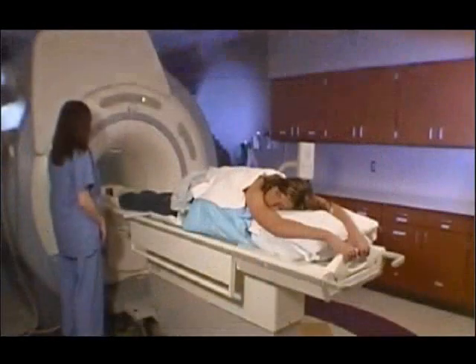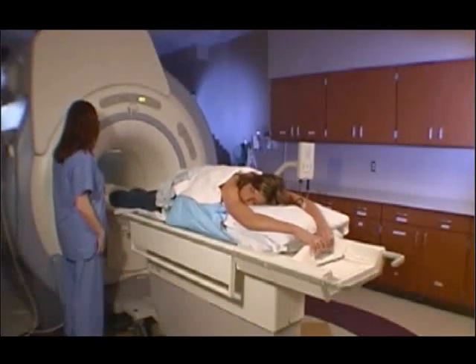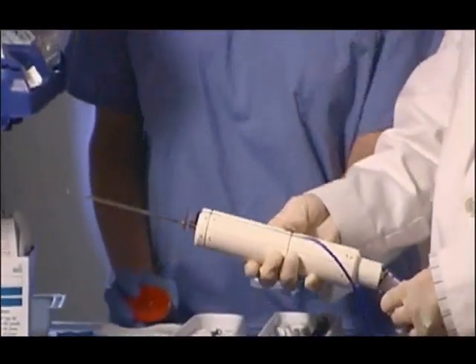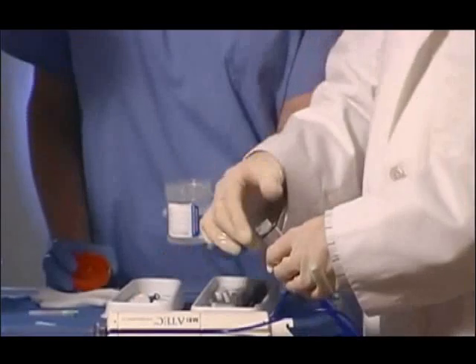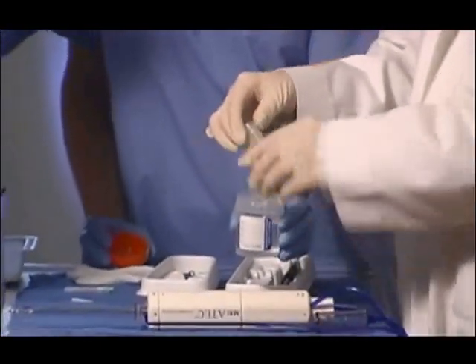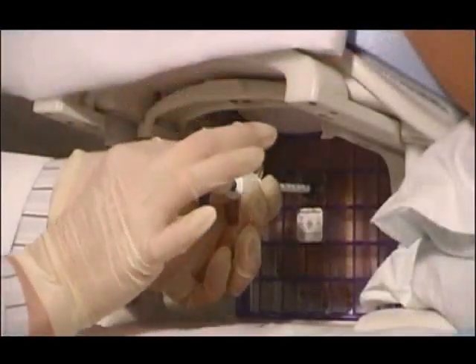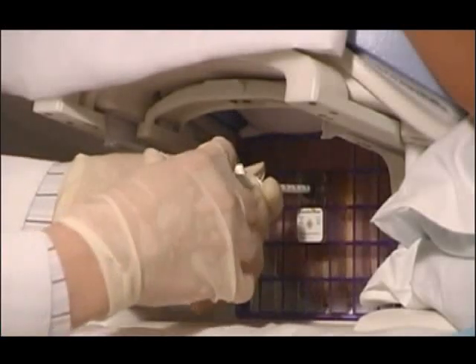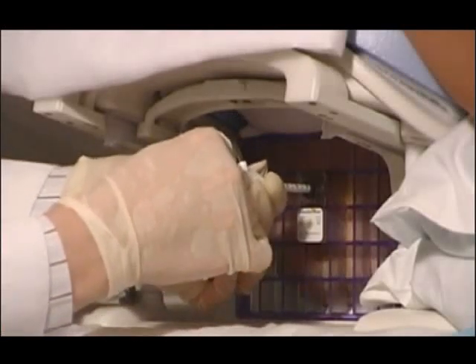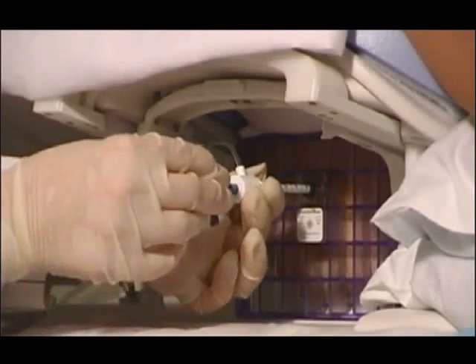Image the patient to confirm accurate removal of the area of interest. Tissue samples are then removed from the ATEC collection filter and sent to pathology. Once confirmed that the tissue from the target area has been removed, place the biopsy site marker and confirm with another set of images.